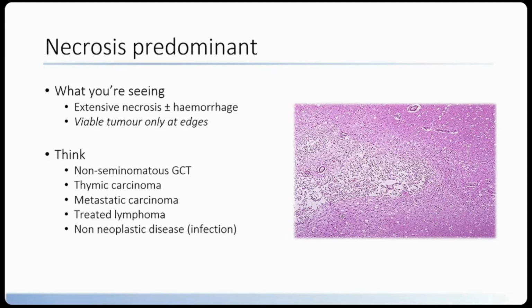So it's really important to look carefully for histological features that may lead you down that route, whether that is granulomatous inflammation or fungal spores. If you have nothing else, I would strongly suggest doing special stains for Ziehl-Neelsen and Grocott to look for potential pathogens if required. I'd also say that in terms of handling these, if I don't see anything, I will cut two or three levels before I would ever sign out a case that's necrotic, in order to make sure that we're not missing anything on any deeper levels.